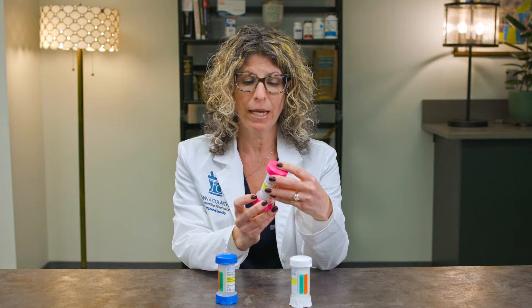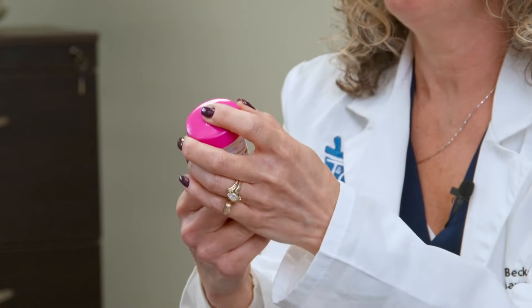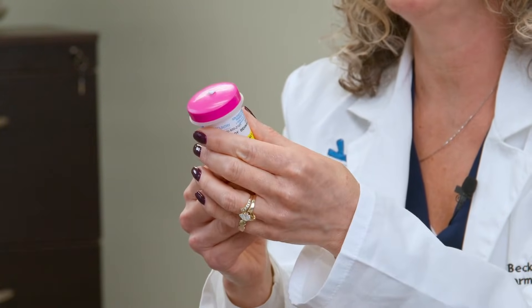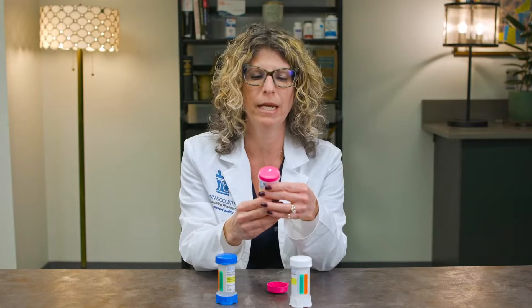For instance, the one I have in my hand is four clicks per dose per day. First, you're going to take off the top. You're going to make sure that the cream is even with the top of the container. If there's excess like there is on this one, you're going to wipe it clean before applying your medication.